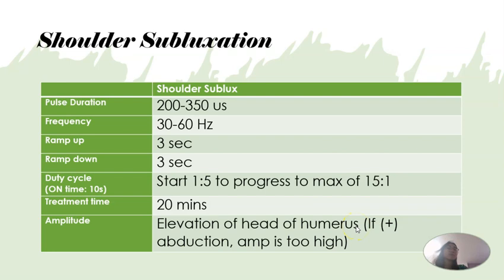During the face-to-face, you will see that. If there is abduction, it means the amplitude is too high.